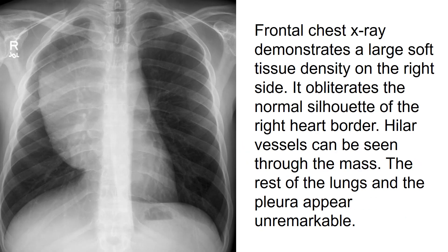This frontal chest X-ray demonstrates a large soft tissue density on the right side. It obliterates the normal silhouette of the right heart border. Hilar vessels can be seen through the mass. The rest of the lungs and the pleura appear unremarkable.